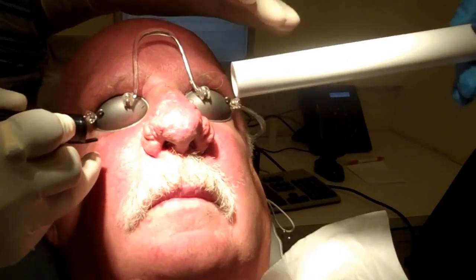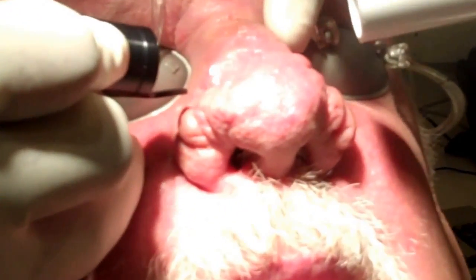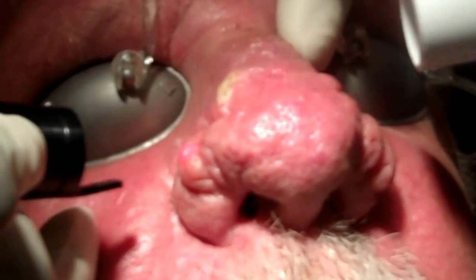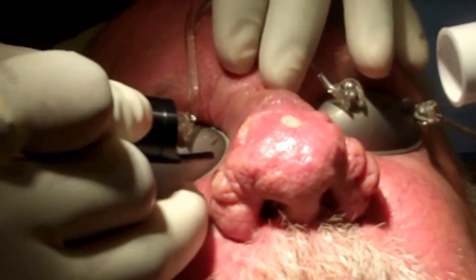So, back to the device. Let me know if you feel anything, sir. Okay? How's that? No, I can't feel anything. Nothing there? No. What about here? No, nothing there. So that's pretty much numb with just three injections.